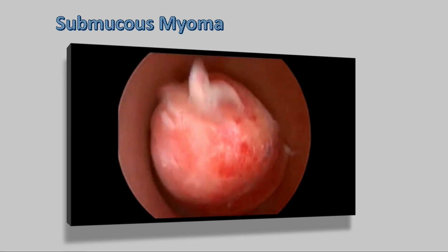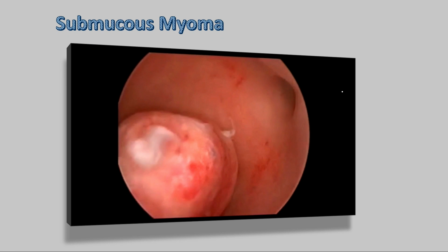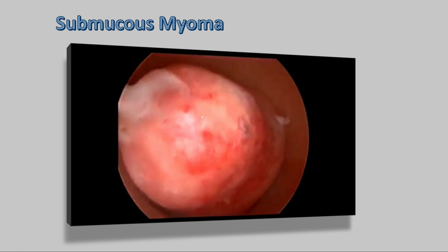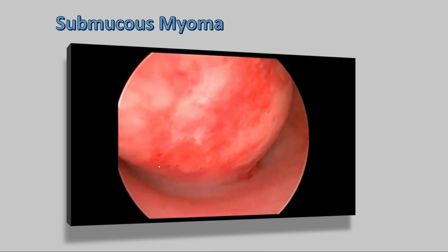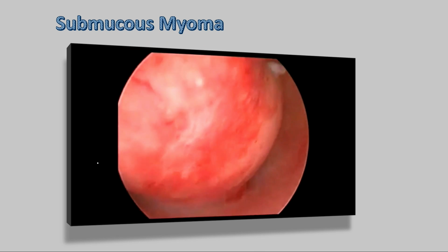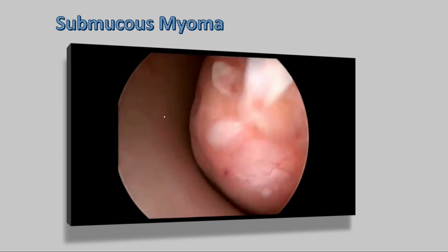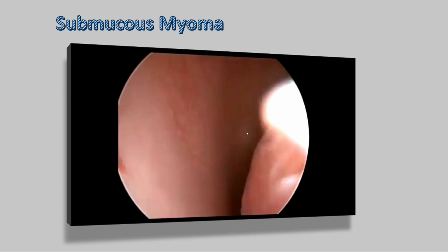You will look for the ostia. This ostia is okay, this is fine. This ostia is doubtful, you will enter and try to go in between the gap and enter by telescope and try to go near the ostia.